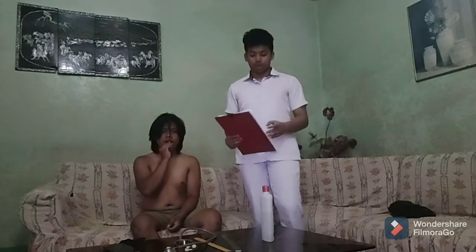Then ask the client to take slow, deep breaths through the mouth. Listen at each point to the breath sounds during a complete inspiration and expiration. So listen for abnormal sounds such as the crackles and the wheezes, and for coughing and abnormal respiratory effort.